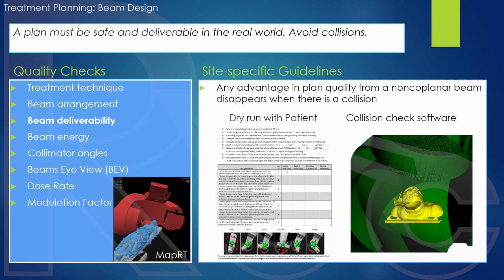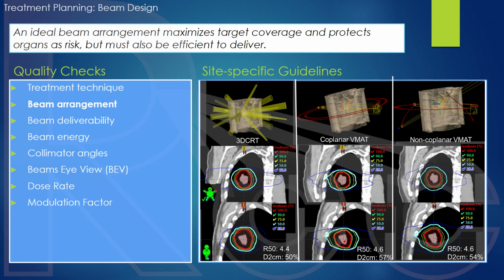Okay, sorry, Justin, there is a question about it. Can you elaborate about what exactly is meant by exit dose is preferred over the entrance dose? Oh yes, that is an excellent question. What I mean by that is that let's say that we have two opposing gantry angles. And within that gantry beam's eye view, there's a target which we want to treat. And there is also an organ at risk. And so we get to pick one of those two opposing beam angles.